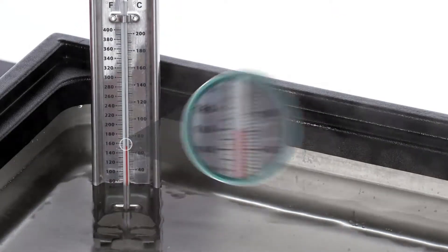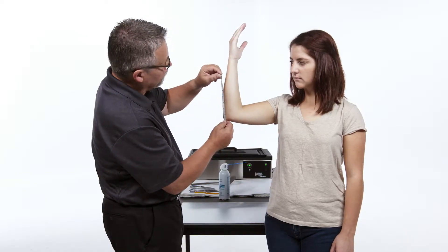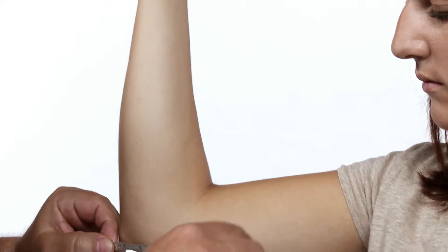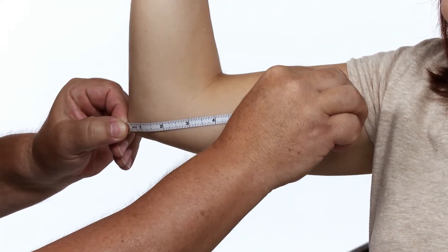Turn on the splint pan and heat to 160 degrees. Using a tape measure, measure 2 thirds the distance from the elbow to wrist and 2 thirds the distance from the elbow to shoulder. This will be the length the splint material will be cut to.